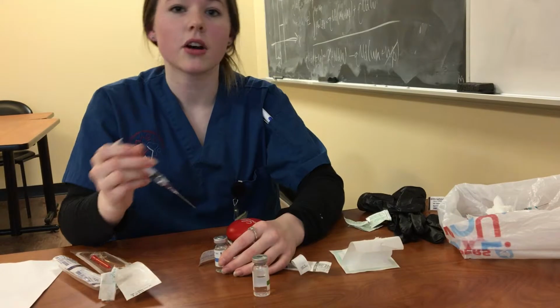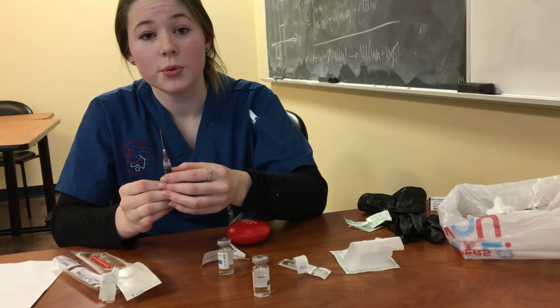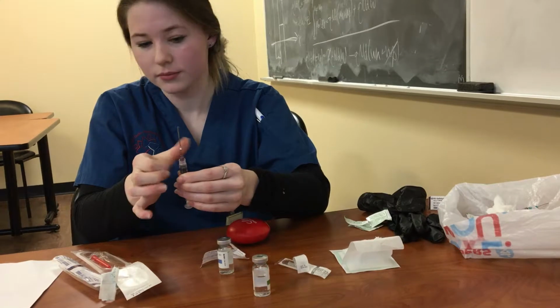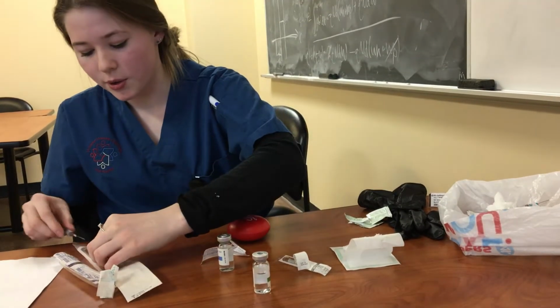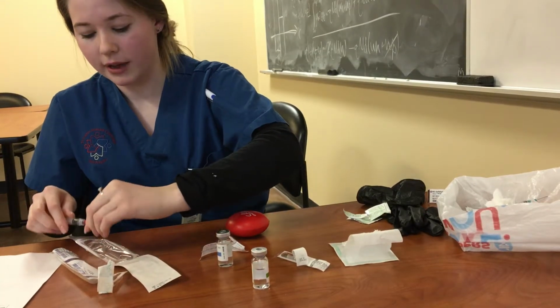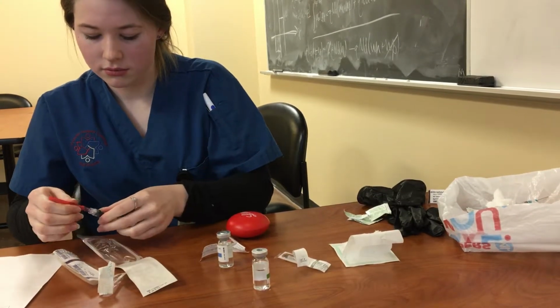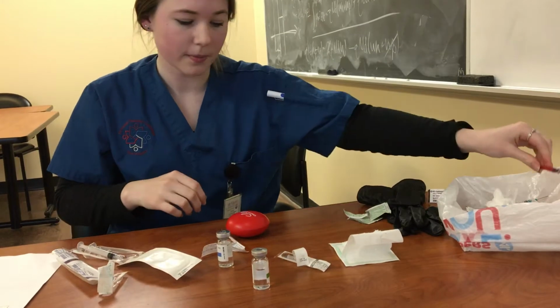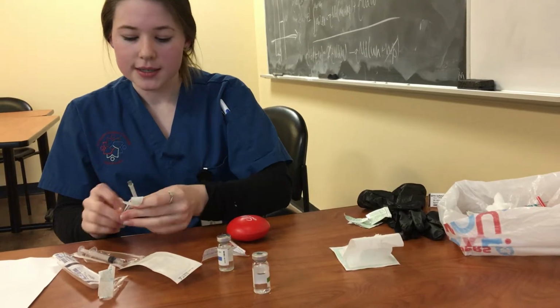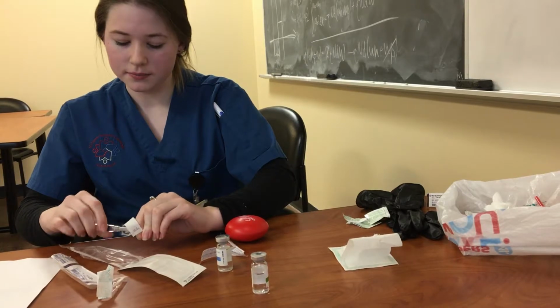milliliters. And like always, you want to make sure that you're very precise in your measurement. So I'm looking at it here. I have 0.5 mils, and I want to make sure that I don't have any air bubbles. Perfect. So I'm going to place my needle back into the bevel cap and remove this aspect of the needle. Place it back into the little house. And now I'm just going to attach it to the IM syringe, which I've spoken about previously. And luer lock that in.